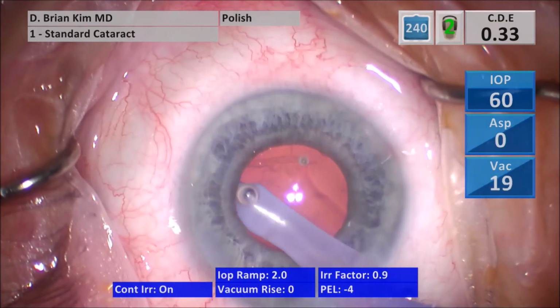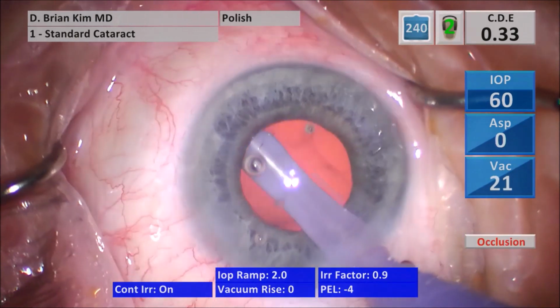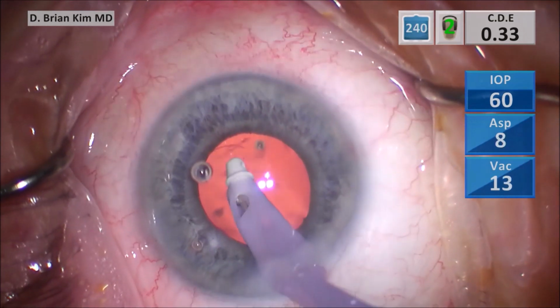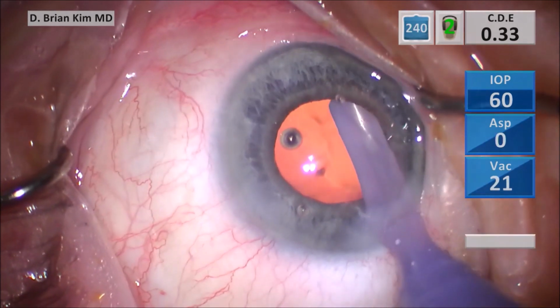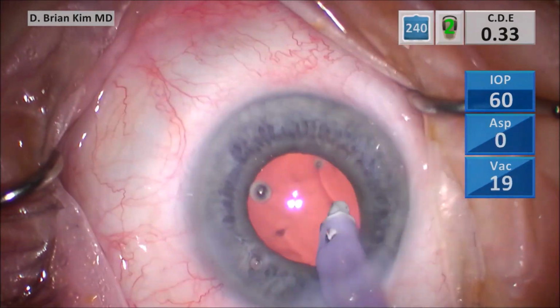And so I like to switch to the polish mode and be very gentle sweeping. I notice that with the polish mode, even if I am sucking on the capsule, it won't cause the capsule to be grabbed by the I/A and cause zonular damage. So I like to do the polish mode in small pupils when I can't see my tip. And then I'm polishing the posterior capsule.